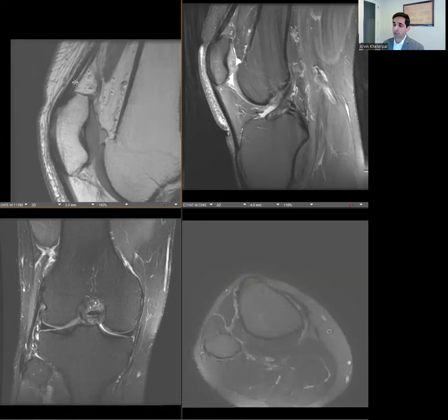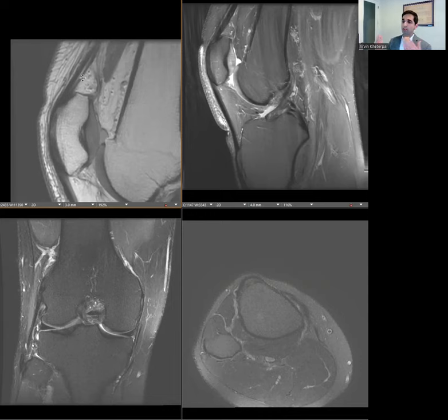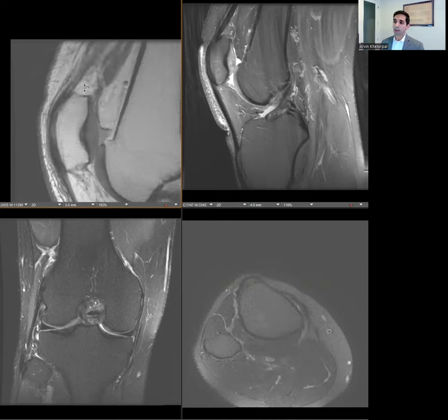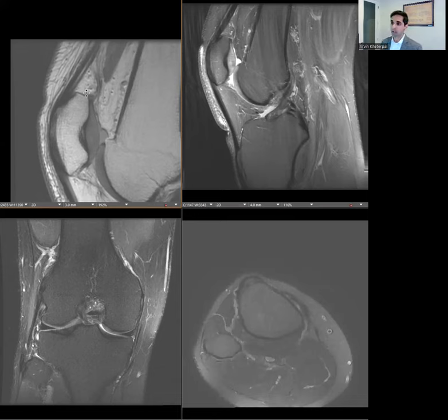The first thing we want to look at is the quadriceps tendon. We can see a thin hypointense line, which is the most superficial portion of the tendon — that's the contribution from the rectus femoris. Then posterior to that, a thicker line which is the contribution from the vastus medialis and lateralis coming together. And then posterior to that, another thin hypointense line — that's the contribution from the vastus intermedius, which is the deepest portion of the tendon.